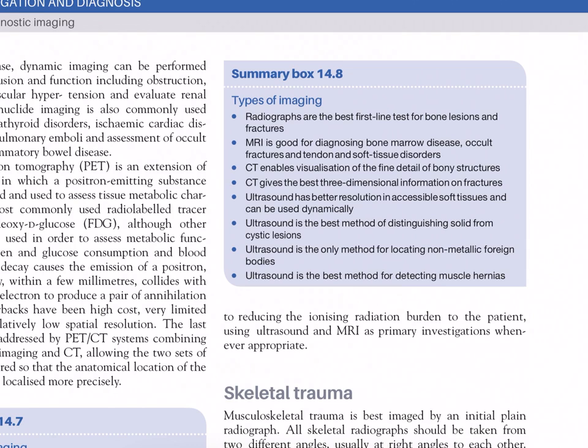Ultrasound has better resolution in accessible soft tissues and can be used dynamically. Ultrasound is the best method of distinguishing solid from cystic lesions. Ultrasound is the only method for locating non-metallic foreign bodies. Ultrasound is the best method for detecting muscle hernias.